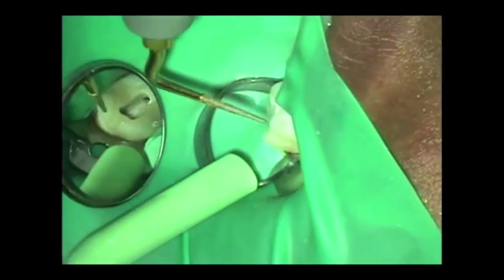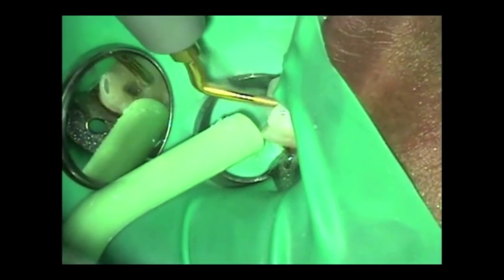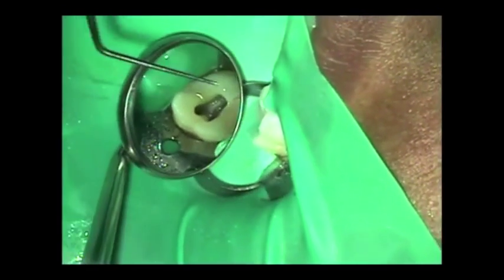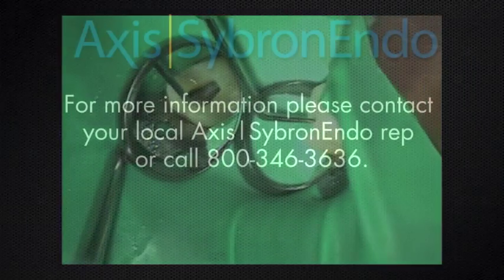Now use it dry for a couple seconds and I'll put the water on — not only to cool things down, but to redefine the anatomy a little bit, to bring back the natural color of the tooth. And then we'll go hunting around again with a sharp endodontic explorer.